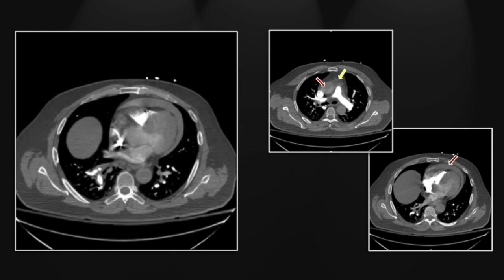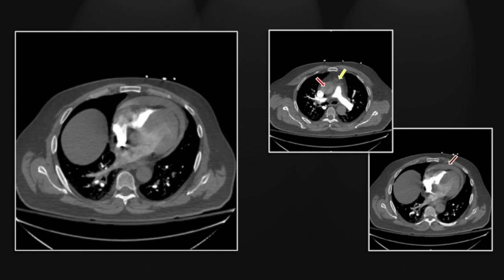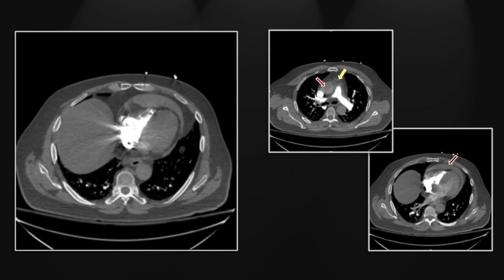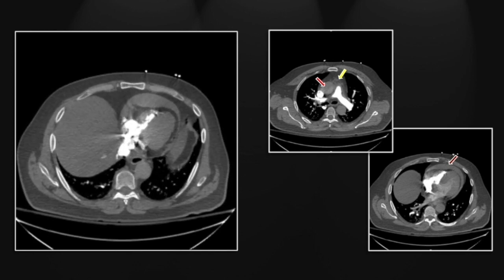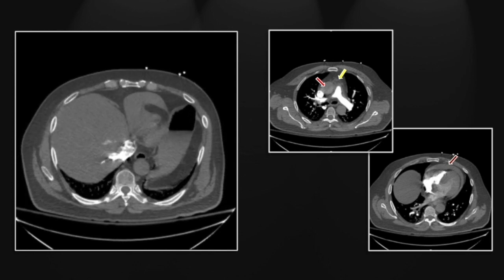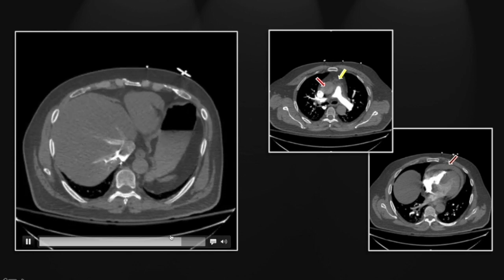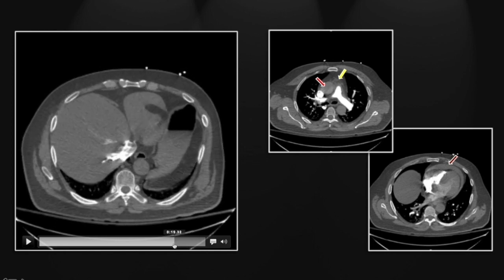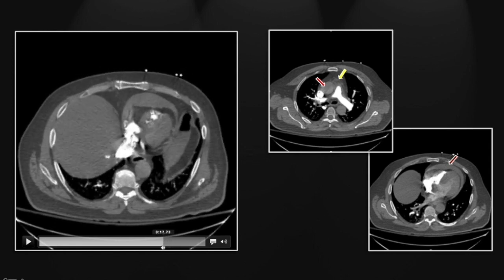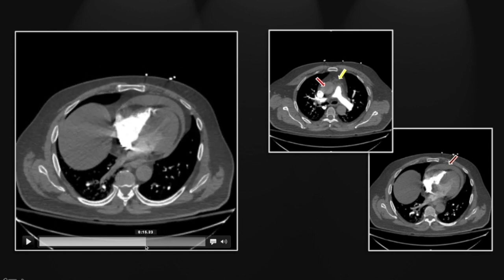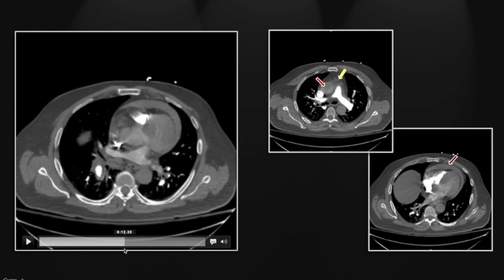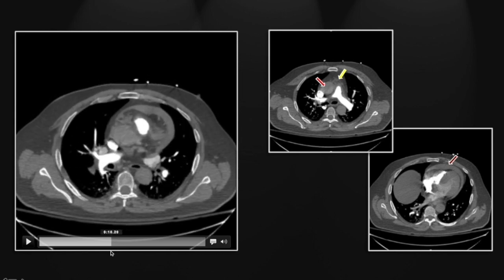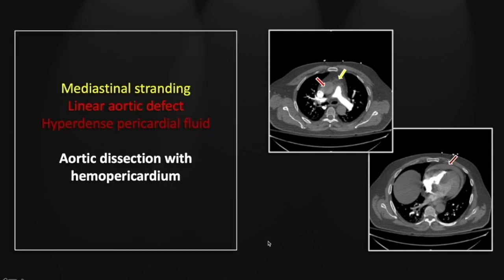Note the distortion of the right ventricle, backflow into the hepatic veins and IVC, and of course an extensive isodense or even hyperdense pericardial fluid collection. So that is an aortic dissection with hemopericardium.